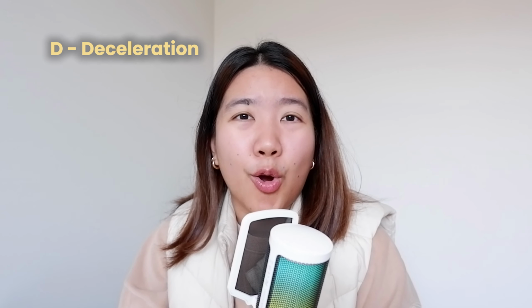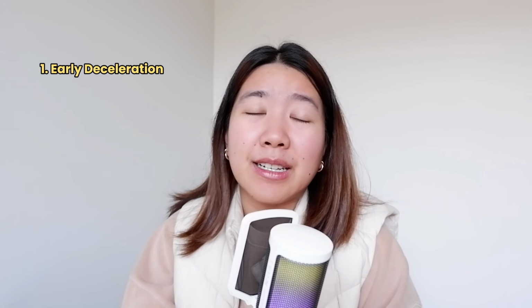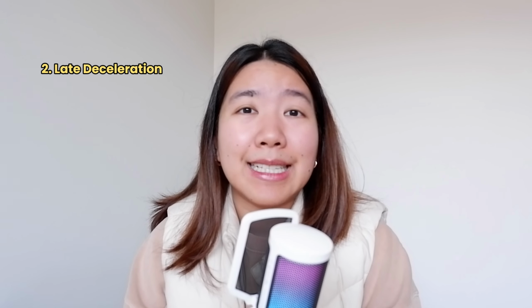Decelerations. Decelerations are transient decreases of the fetal heart rate below the baseline lasting 15 seconds or more. There are 5 types you need to know. The first one is early decelerations. Early decelerations mirror the contraction, so it drops when the contraction starts and goes back to baseline when the contraction finishes. This is considered a physiologically reassuring event caused by fetal head compression, mostly happening in the second stage of labor.